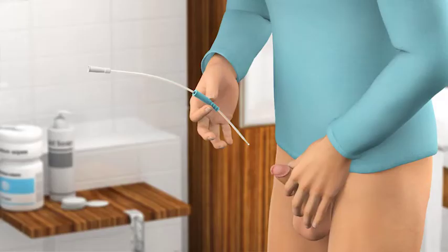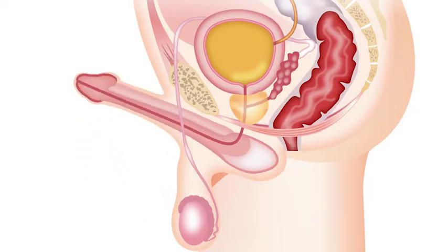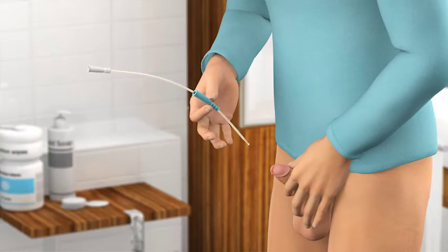Hold your penis pointing upwards and close to your stomach. This will ease the insertion of the catheter as the natural S shape of the urethra then changes into a U shape. Provide a gentle pressure to the head of your penis to open the urethra, but be careful not to squeeze your penis, as this may obstruct the passage of the catheter during insertion into the urethra. To help insertion of the catheter, it is important that you relax.